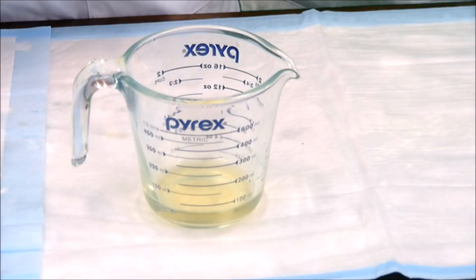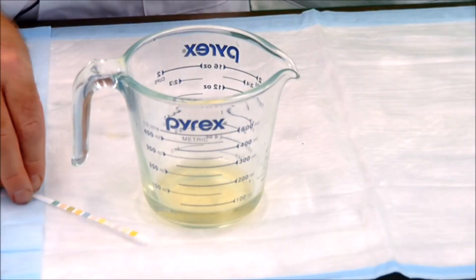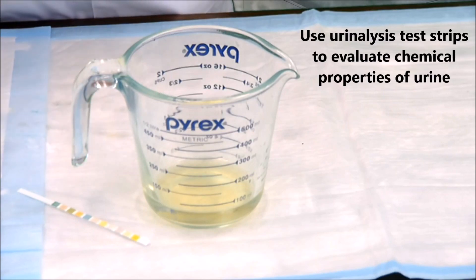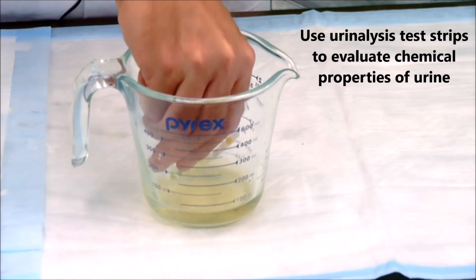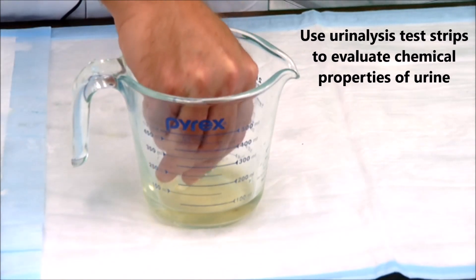So once you've successfully measured your urine, we then want to use one of our urinalysis test strips to measure the chemistry of that urine. So simply take out one test strip and then place it into the urine and make sure that all the pads are equally covered with urine.